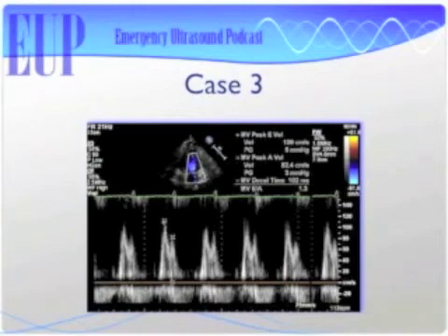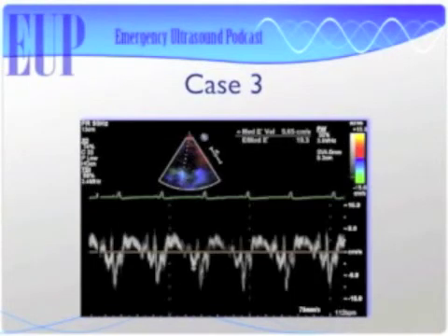So remember, she had, what did she have? She had dyspnea and cardiomyopathy. Okay, so she's short of breath. So we're trying to figure out why she's short of breath. So mitral valve inflow was, we decided, pretty normal. And then we do our TDI, and that is... was it pseudonormal? Ah, E prime is less than A prime.